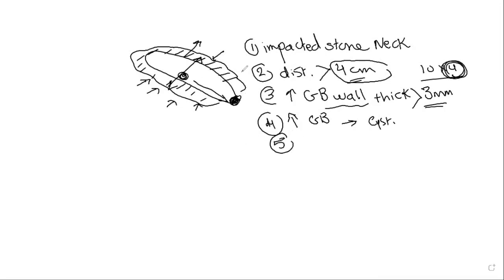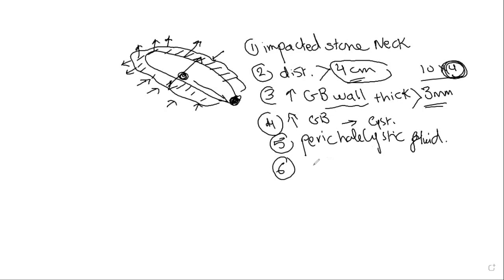Now, this inflamed gallbladder would do what? Absolutely right, it would extravasate fluid. And we would see pericholecystic fluid, or even we would see an abscess. And lastly, as we have seen in the previous slide, the positive Murphy sign. This is important, very important.